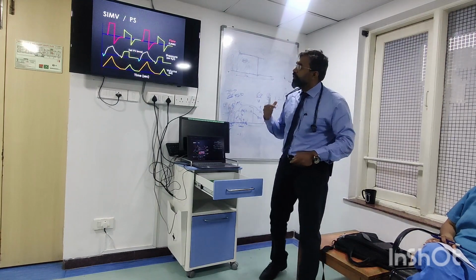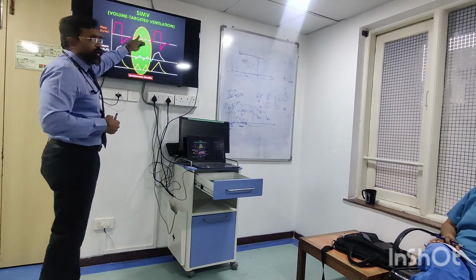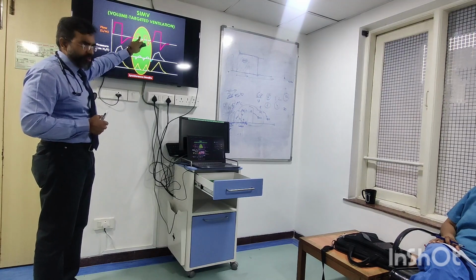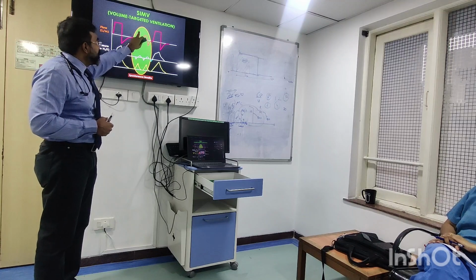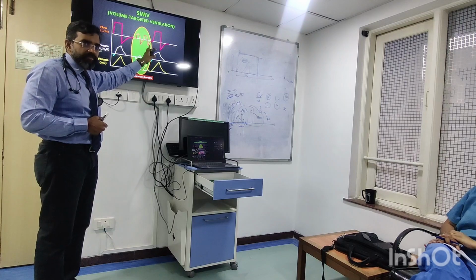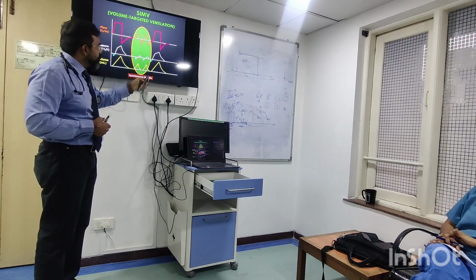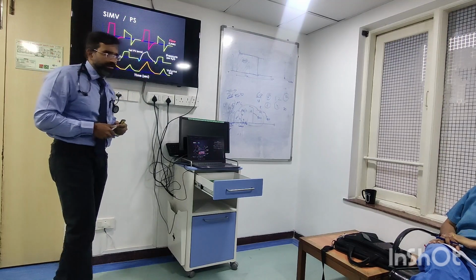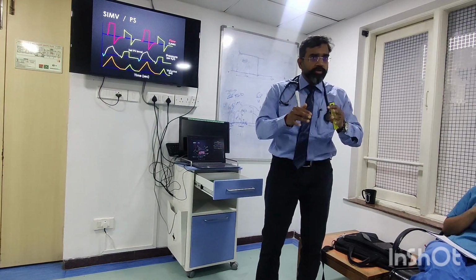Okay, SIMV period. That's what you should understand. Now, we just talked about the fact that you have these breaths in the middle. If I add some kind of help to this patient here, I can do that. And to add that help, if I add a pressure support to this breath, you will give an extra pressure which will help, and that is what is happening in this. You are adding an extra pressure support.